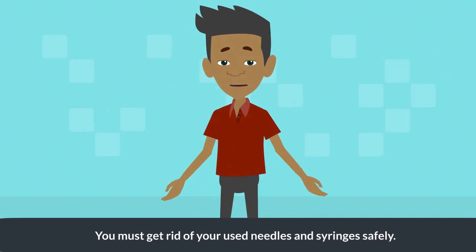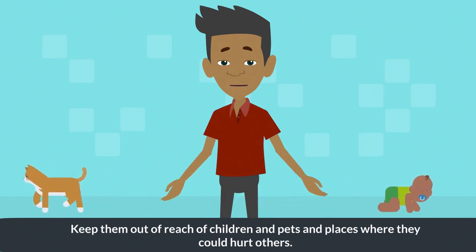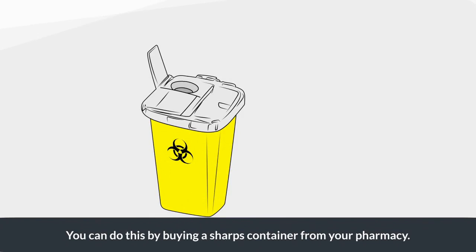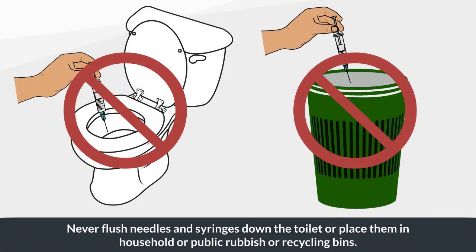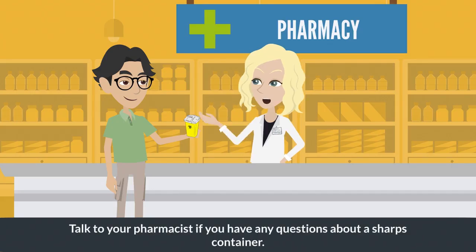You must get rid of your used needles and syringes safely. Keep them out of reach of children and pets, and away from places where they could hurt others. You can do this by buying a sharps container from your pharmacy — this is a special container made of hard plastic with a tight-fitting lid so used needles and syringes can be stored securely. Never flush needles and syringes down the toilet or place them in household or public rubbish or recycling bins. Once your sharps container is full, take it to your pharmacy for safe disposal.